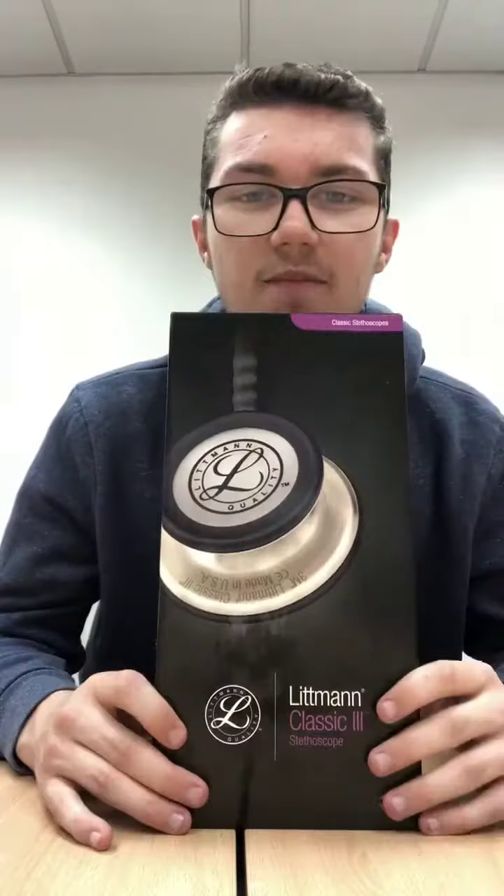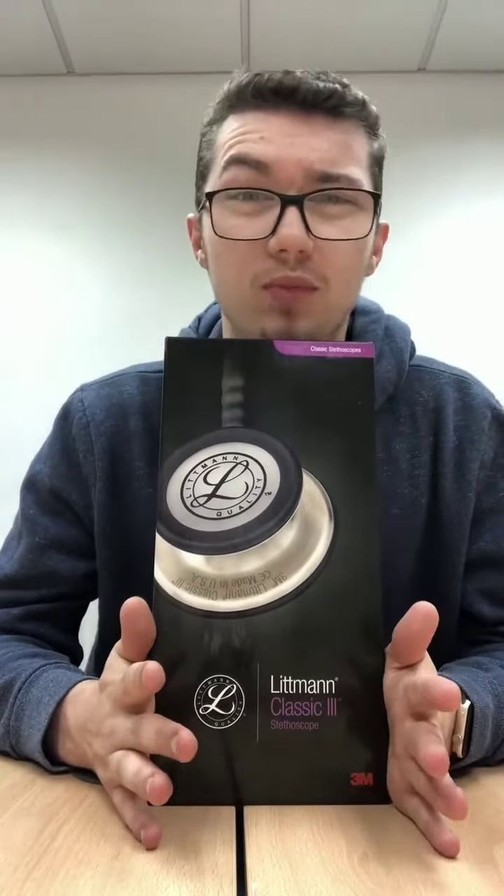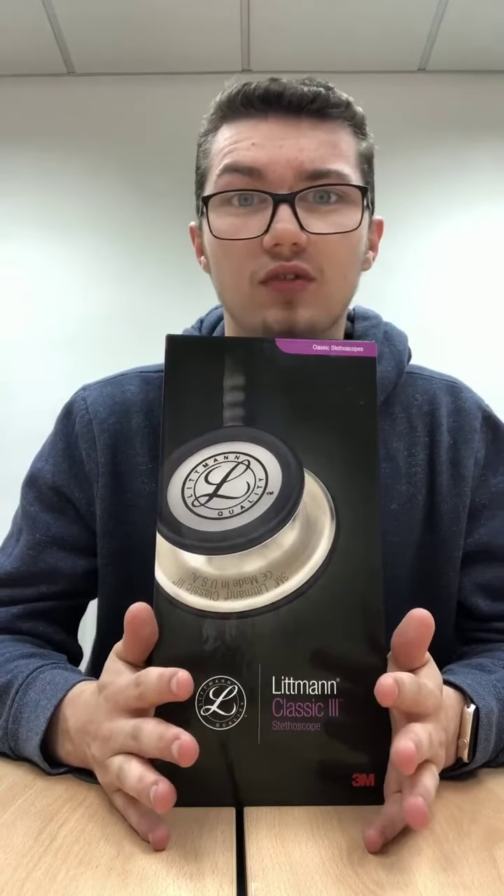Hi guys, it's Rhys here again on behalf of SP Services. Today I'm going to be doing a review and sort of a comparison on stethoscopes. I spoke to SP Services and they sent me one down — I got the black one. I've been using it for coming up to two months now, so I'm going to run through a couple of pointers that I've picked up with it, what I like about it, and you can decide whether it's for you as well.